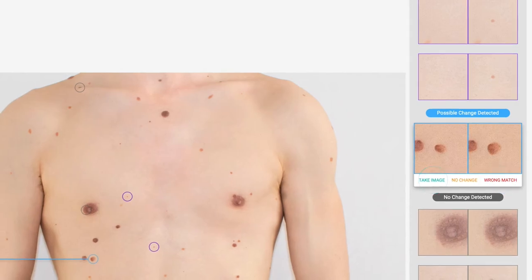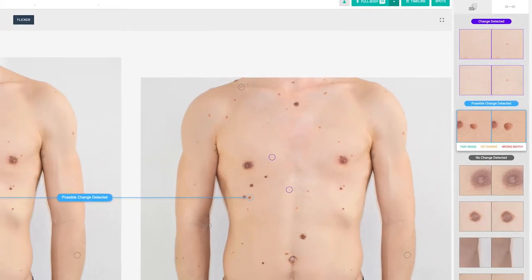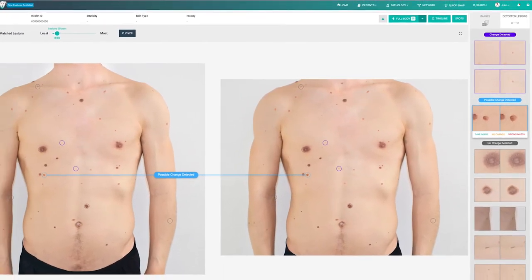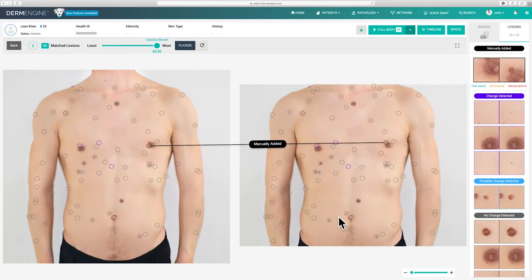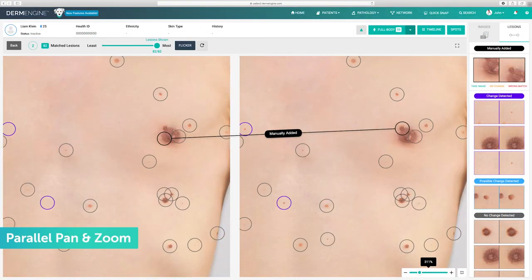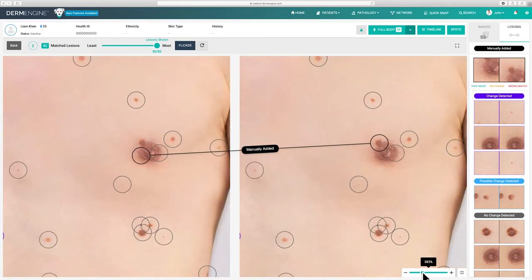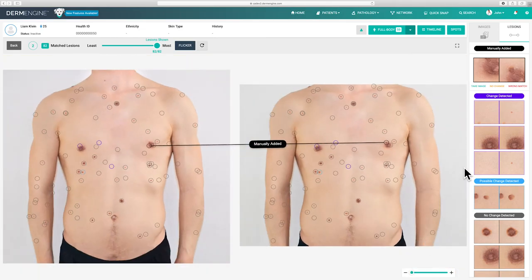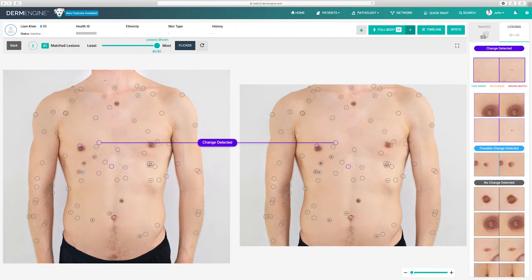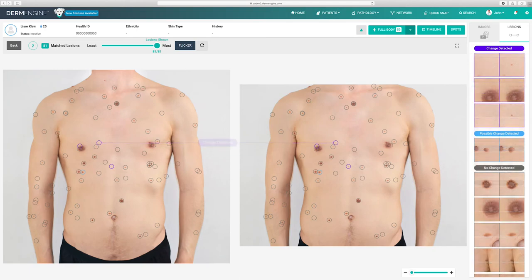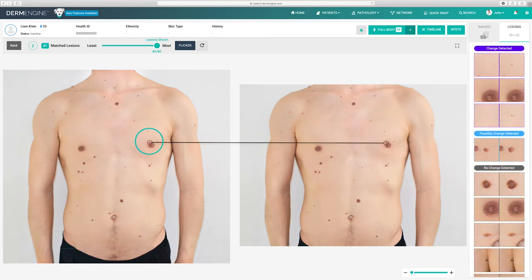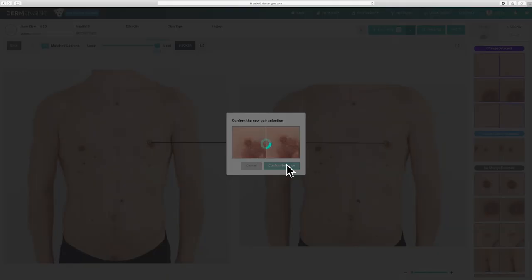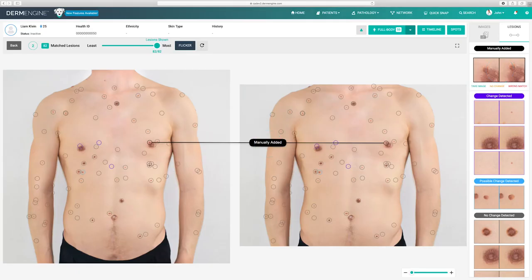Please note, when selecting take image, if there is a changed lesion that has not already been mapped, you'll be prompted to do this on the mobile app. To get a better look at any changes in a lesion, use the parallel pan and zoom feature to get a magnified view of both lesions at once. If you select wrong match, the matched pair will be removed. You can now create a new pair at any time — click on a lesion you would like to map, then click on its counterpart in the second image. Confirm you would like this pair to be matched; your new pair will then be labeled manually added.